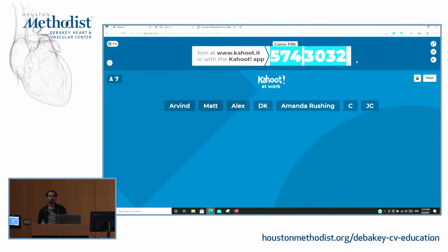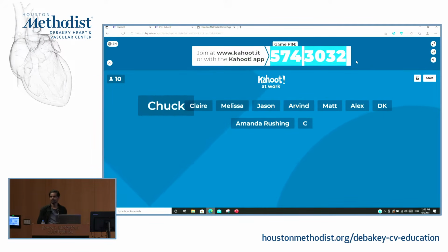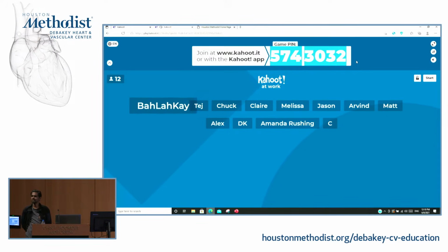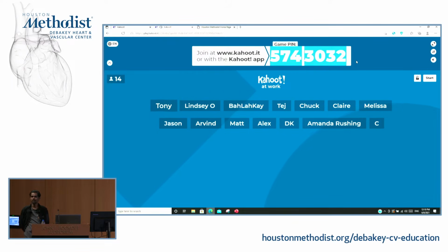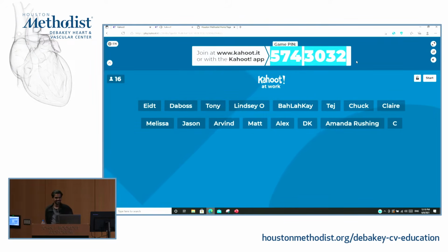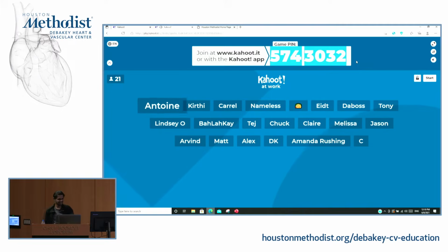Maybe while people are joining, as a resident or an intern, when you look at the CT images, what are some of your common challenges with the CT? Any thoughts? What do you struggle with the most? Hopefully I'll answer that question towards the end of these 10 questions.